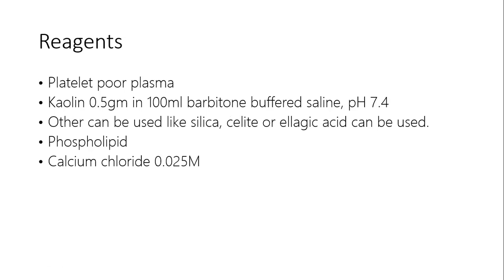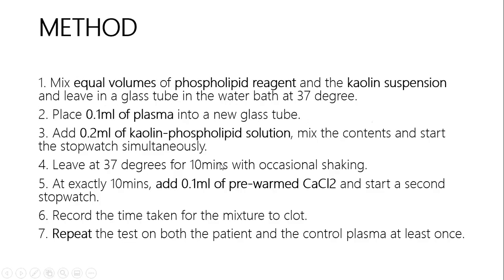Other methods use silica, celite, or ellagic acid. Phospholipid is also incorporated. Calcium chloride is also used.